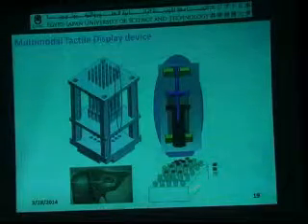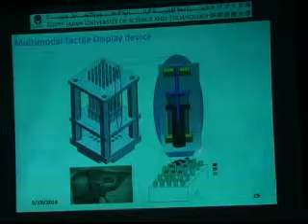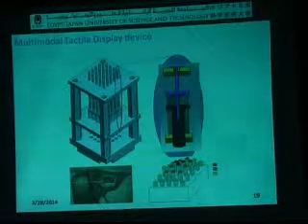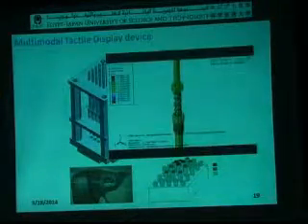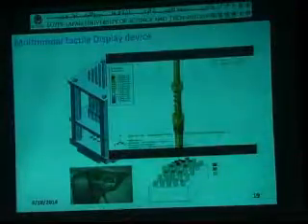So by this device, if you have a liver with some abscess here, you can display the shape of the liver, and those pins you can make harder. If you palpate it, you will feel hard. And of course, in our procedure, we have to do some simulation to test this device. And actually, this device we succeeded to make only one unit, only one pixel. In the future, we will extend it to, for example, an array with 10 by 10 to make a whole device.